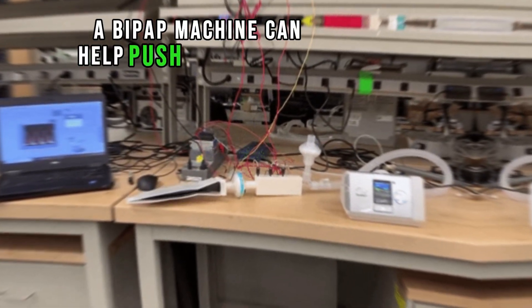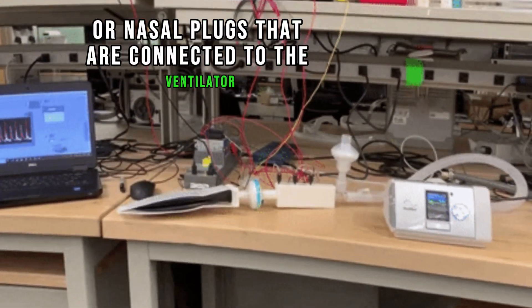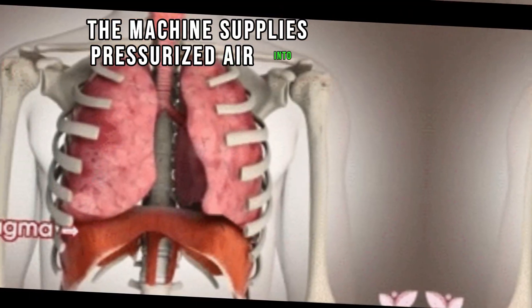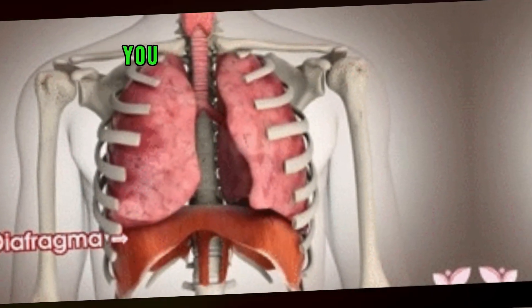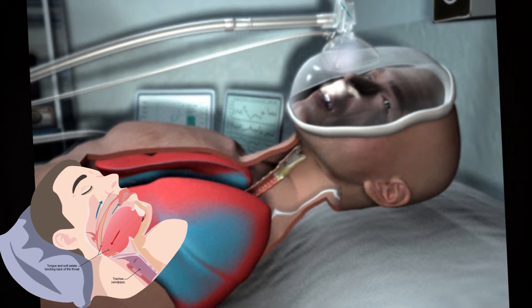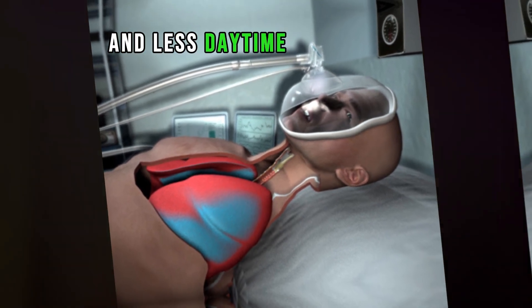If you have trouble breathing, a BiPAP machine can help push air into your lungs. You wear a mask or nasal plugs that are connected to the ventilator, and the machine supplies pressurized air into your airways. It is called positive pressure ventilation because the device helps open your lungs. You may notice immediate improvements after starting CPAP treatment, such as better sleep quality, reduction or elimination of snoring, and less daytime sleepiness.